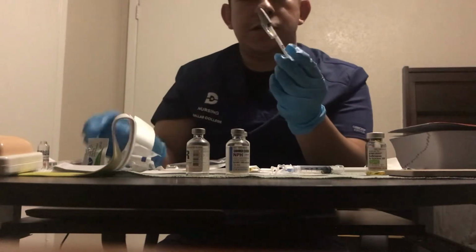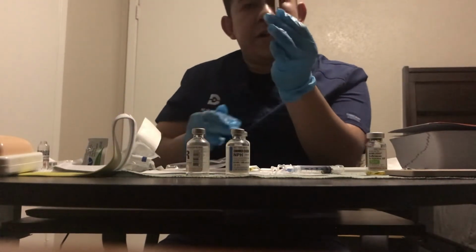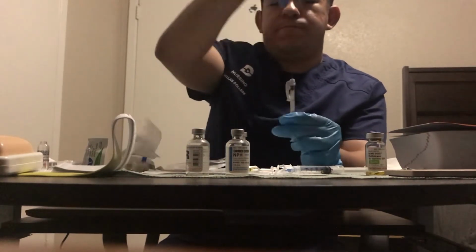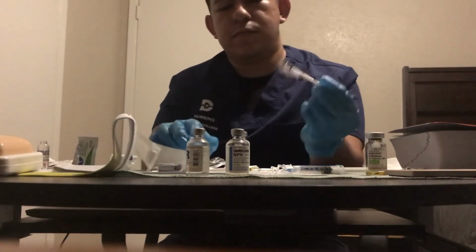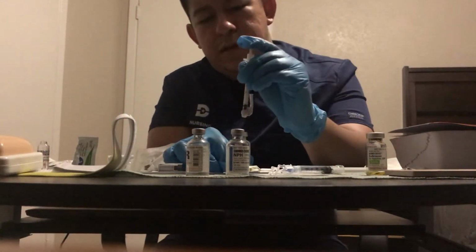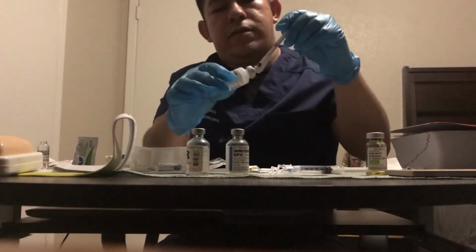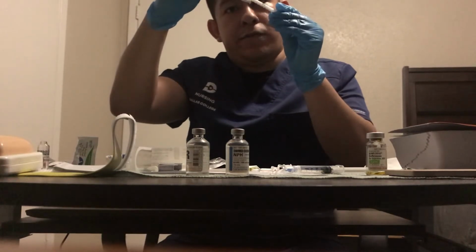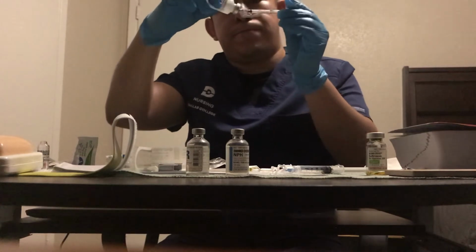Take out your syringe. You draw up 0.1 mLs of air. Take the cap off. Inject your 0.1 mLs of air. And then pull back out the 0.1 mLs of PPD.